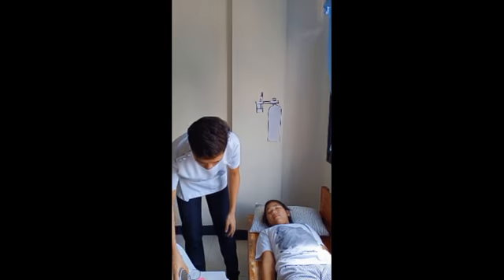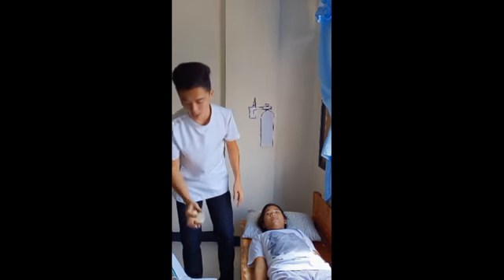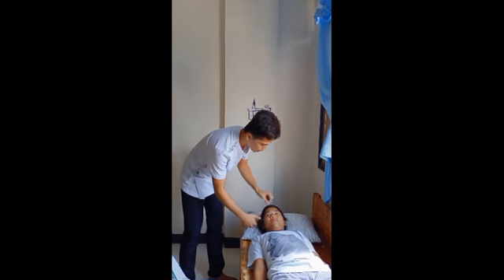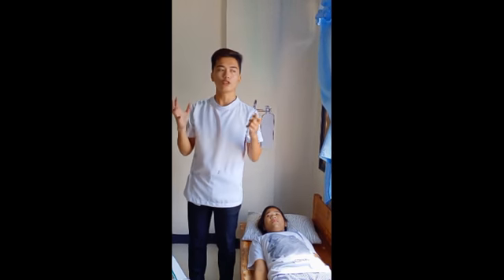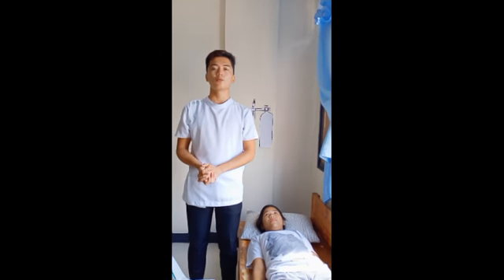So the next is, I forgot, if the patient can keep the nasal cannula on her face, you need to use tape. So let's assume that I have tape. This is the tape. You need to put it here side by side to keep the nasal cannula on her face for good condition and good procedure.